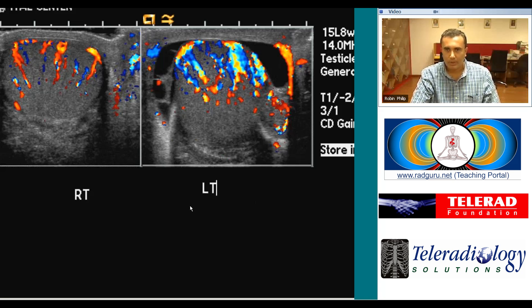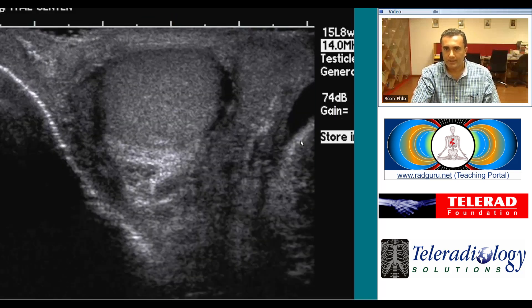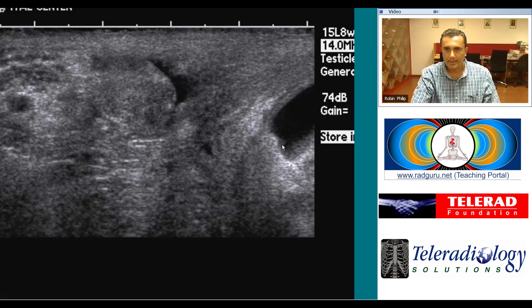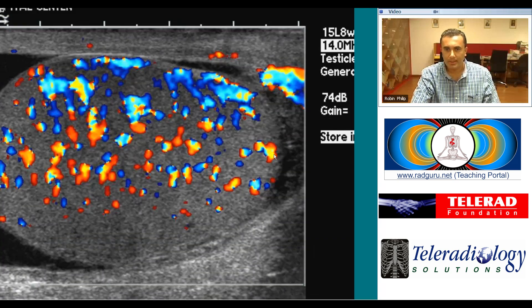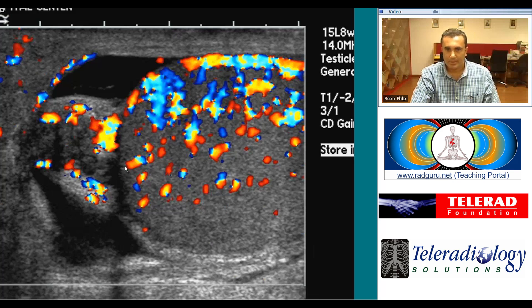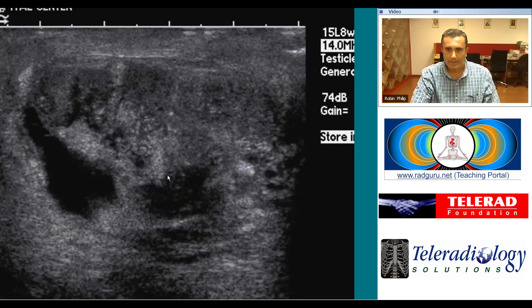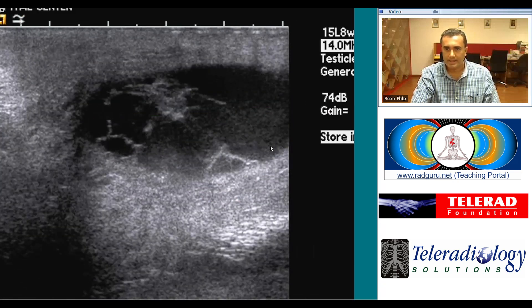Looking at this scan, the right testicle shows a normal pattern of vascularity. Using that as the benchmark, the left testicle is obviously hyperemic and hypervascular. In addition, there is a hydrocele that is somewhat complex — it has internal echoes and septations — and the epididymis itself is also enlarged and hyperemic. As we scroll through the images, the left testicle lights up like a light bulb because of hypervascularity, and the left epididymis is similarly thickened and hyperemic.